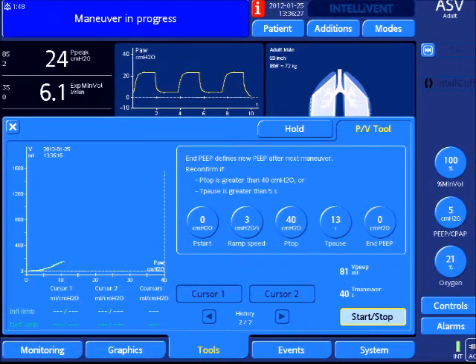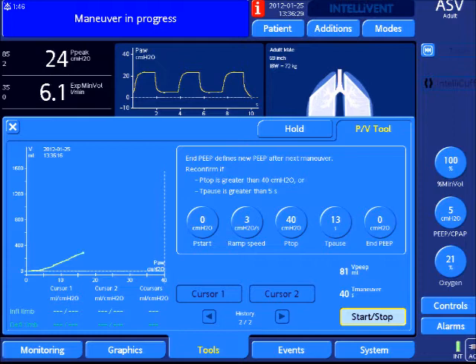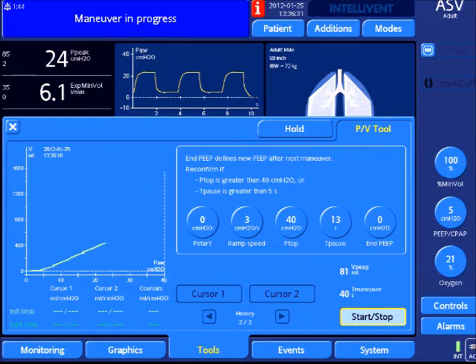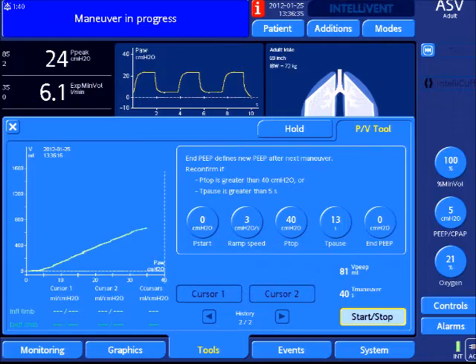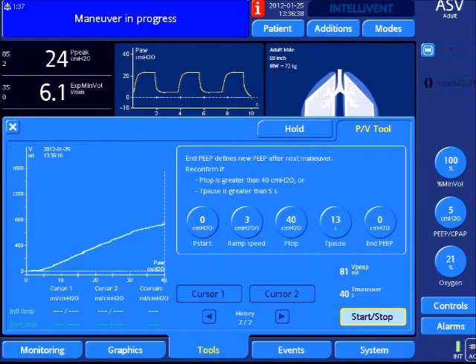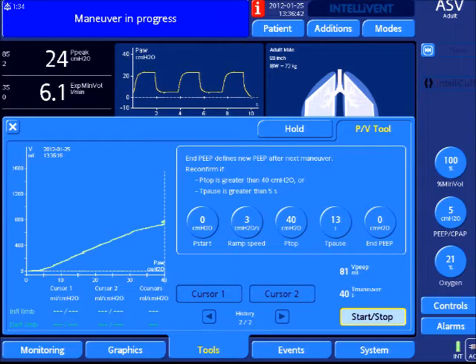What we'll see with this demonstration is very little hysteresis, hardly any lower inflection point, and very little recruitability.